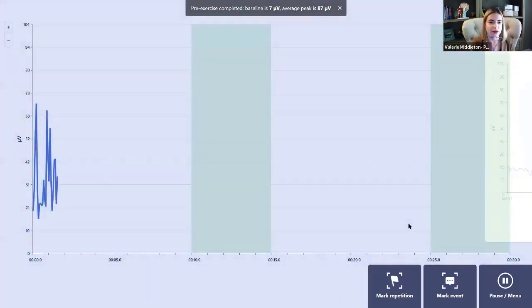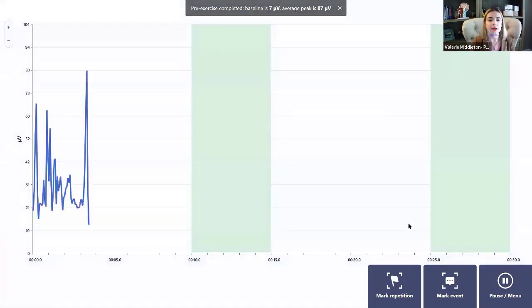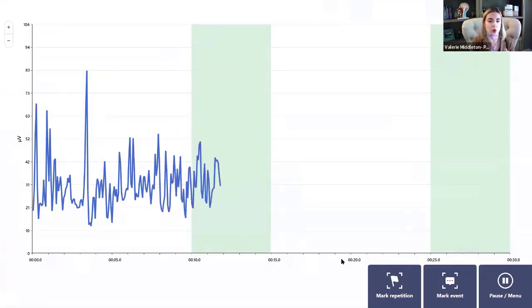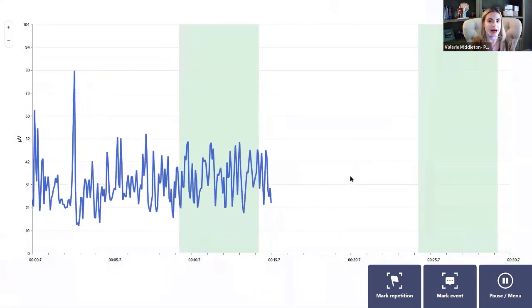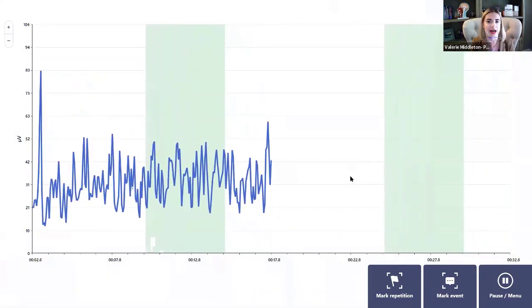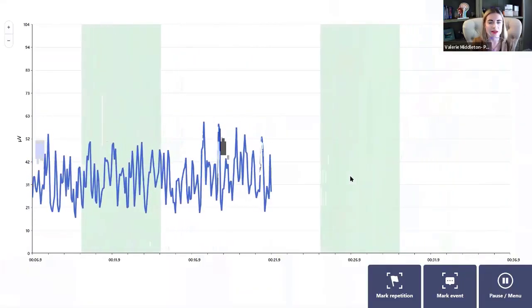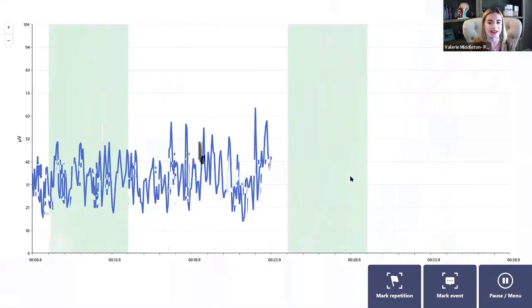So I'm going to accept the 3 that I have. And it's already going to default for me, right? We're going to talk about editing parameters in a moment, but we already talked about it defaults to 5 seconds here for our work cycle and then 10 seconds for our rest. So let's say in my assessment that I noticed the patient had a significant swallow delay time of 8 seconds. So that swallow command initiation was 8 seconds.